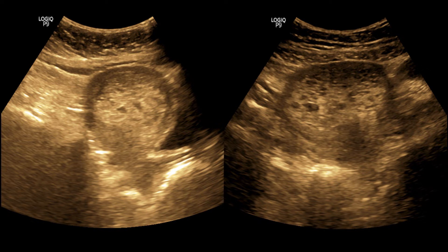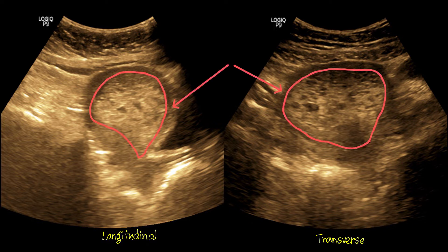This is the picture of the uterus in longitudinal and transverse sections. The urinary bladder is partially filled, as the patient was sent from the emergency department for a rapid opinion. This central heterogeneously echogenic area is the molar tissue.